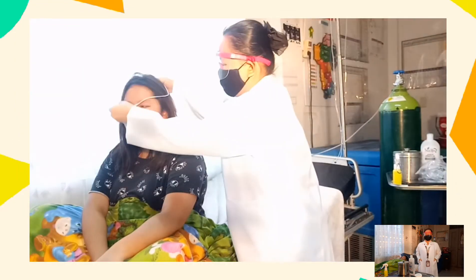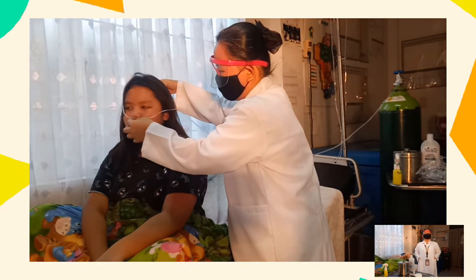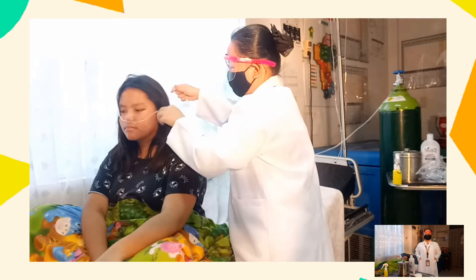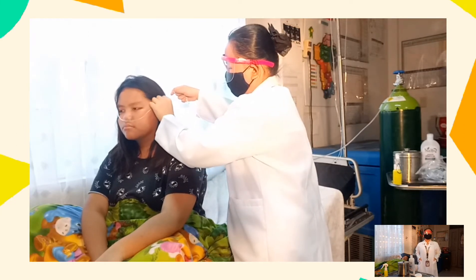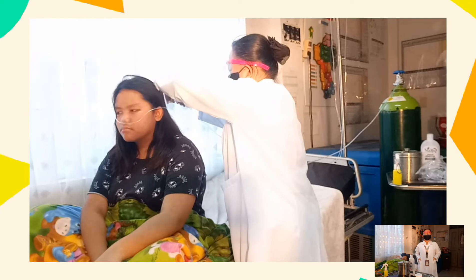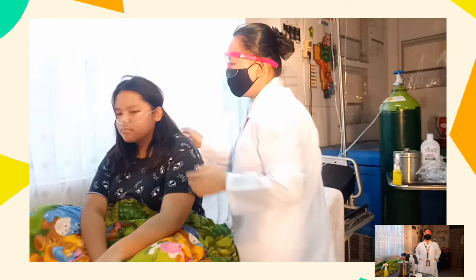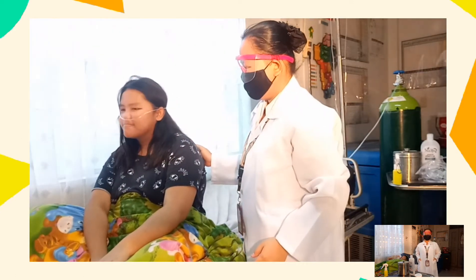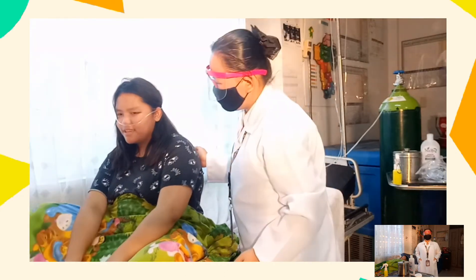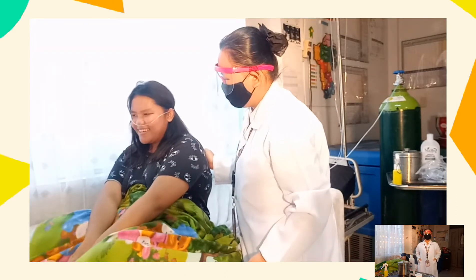Place the prongs in the patient's nostrils. Place tubing over and behind each ear with the adjuster comfortably under the chin. Alternatively, the tubing may be placed around the patient's head with the adjuster at the back or base of the head. Place gauze pads at the ear beneath the tubing as necessary.